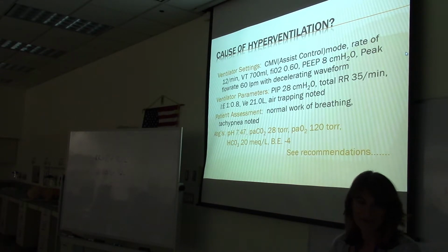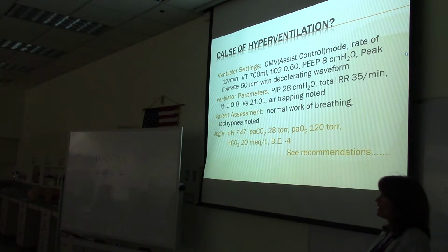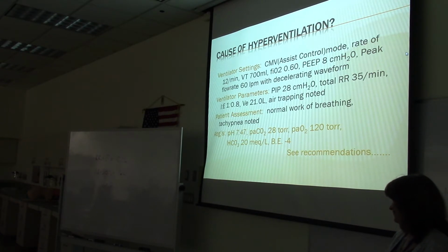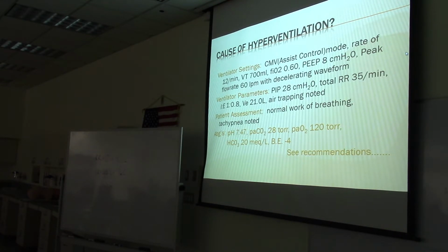But we don't have that, we have a bicarb of 20. What about a leak in the circuit? An auto trigger? Yeah, Ross said that. She said it too low. All right, so this could be also caused by a leak in the circuit, and there's auto triggering. Because obviously from the blood gas, there's no need for such a fast rate.